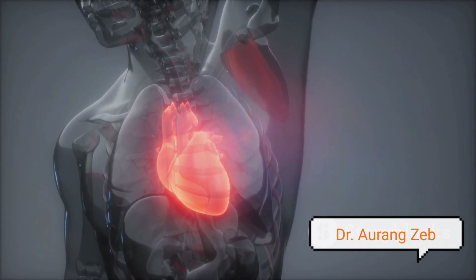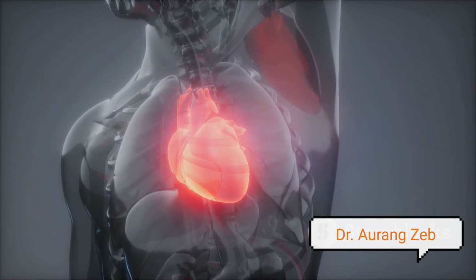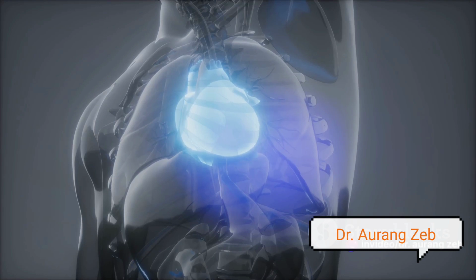We can also see the tricuspid and mitral valves. In this view, we measure the sizes of the chambers and evaluate the function of the mitral and tricuspid valves.